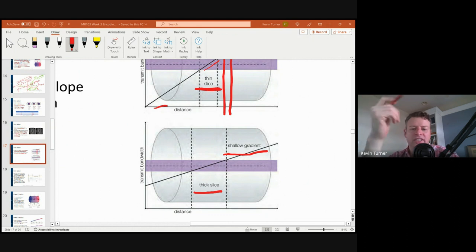Yeah, Joseph, it's usually just set for the exam. Usually the docs are just like, I want to see this thickness on a patient. So like every shoulder you run, maybe 3 millimeter slices. But then every pituitary you run, maybe like 1 millimeter slices.